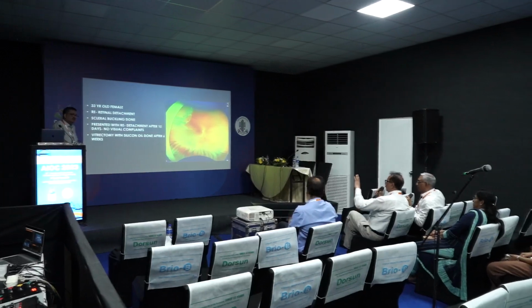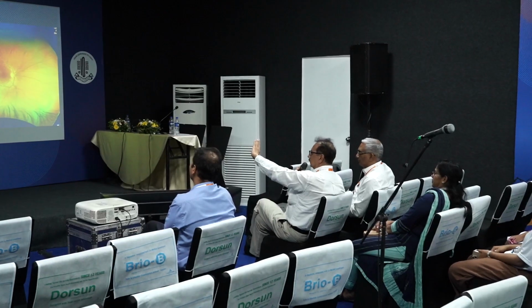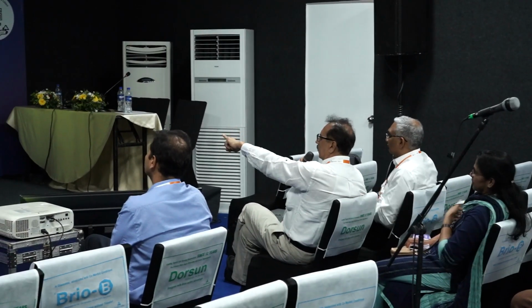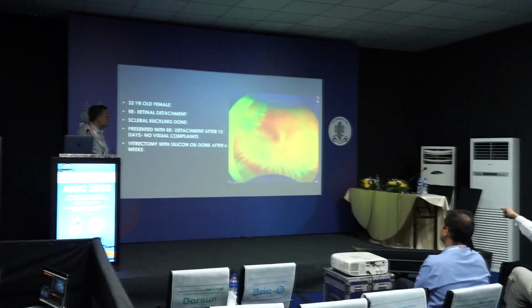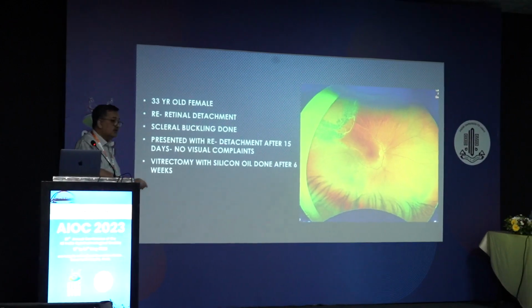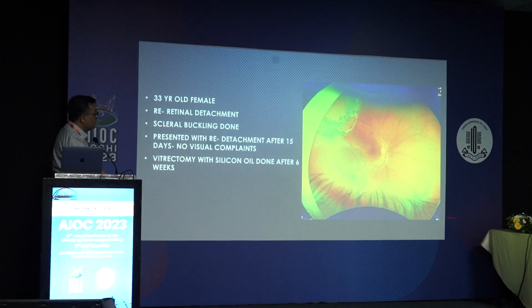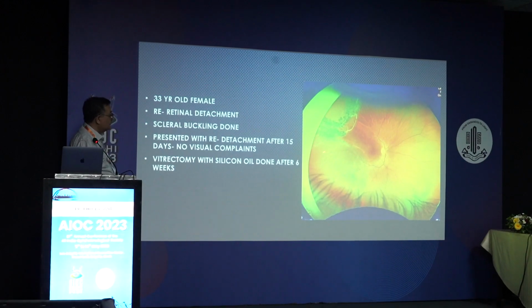If you look at this picture, the top one looks like a subclinical RD which settled, recurred and resettled. But there's fluid here, the elevation in this part. But the demarcation line has actually cut it off, so I wouldn't be very worried about it. What I'm worried about is the inferotemporal quadrant. Actually now I realize that it is going on nasally along that vessel, see the color change. So obviously this patient needs management. I initially thought it was only the upper portion. I didn't realize it was going on this side.